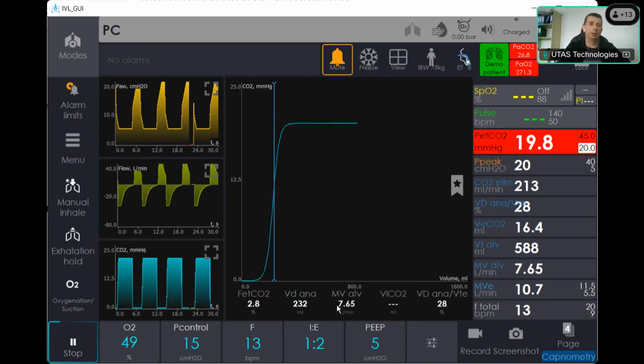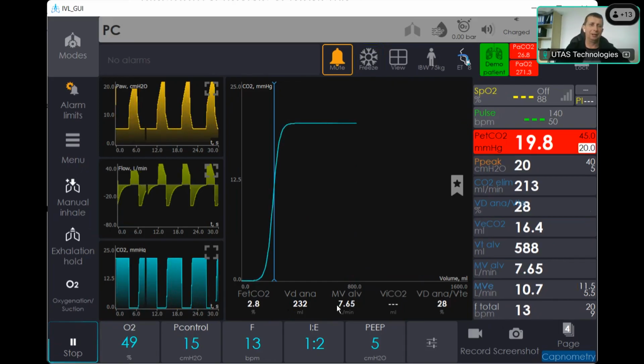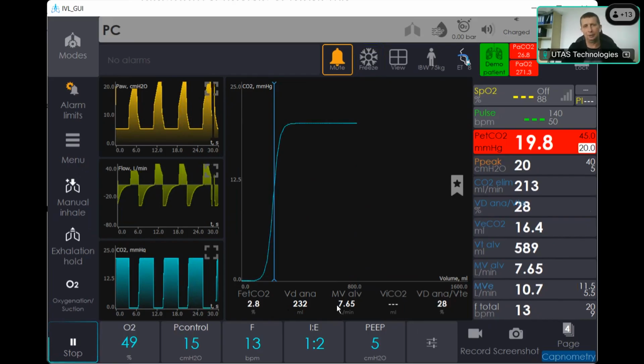If we have, for example, a mismatch between ventilation and circulation, this kind of monitoring will be helpful for you to understand if our settings are enough for alveolar ventilation. So we are not ventilating dead space, but we are ventilating the patient according to his anthropometric data, and gas exchange and delivery of gas is correct, and there are no potential risks for the patient.